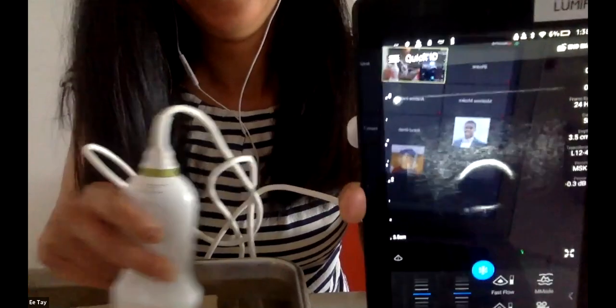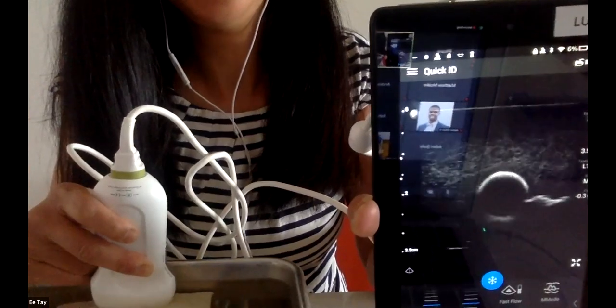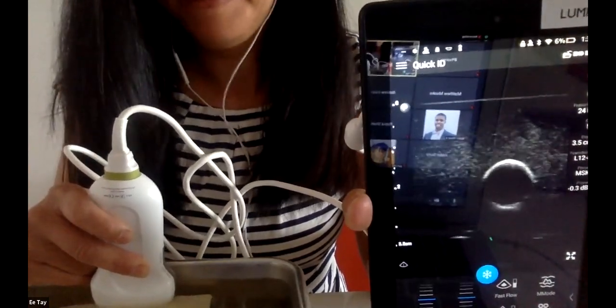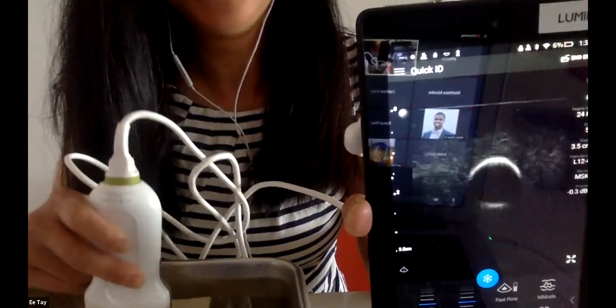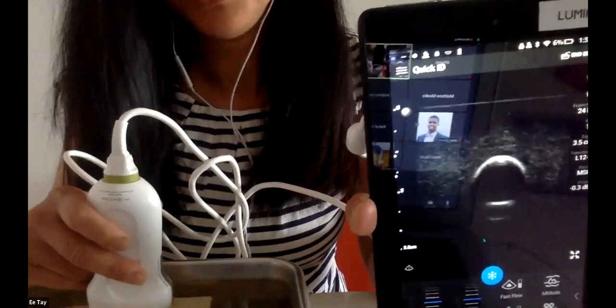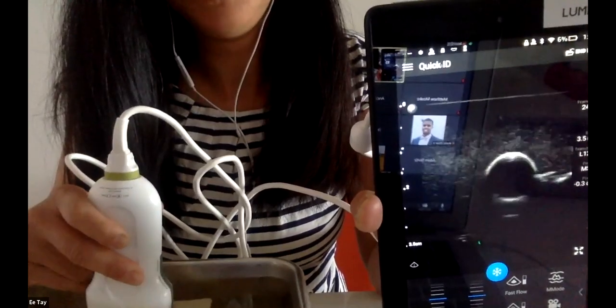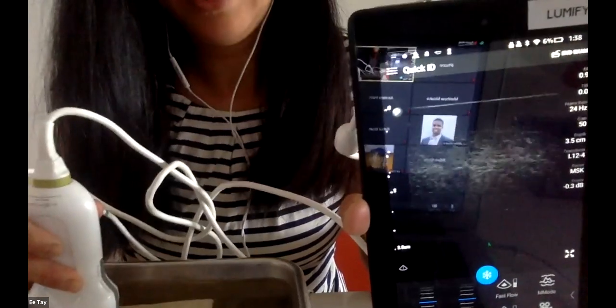Okay, so here is my bubble tea straw, and it's not compressible because it's really hard and rigid. But if it was a Penrose, it can be. So this is actually pretty good for tofu. If you're trying to locate it, I think I also stuck a paper clip in there somewhere that I hope I don't eat later.